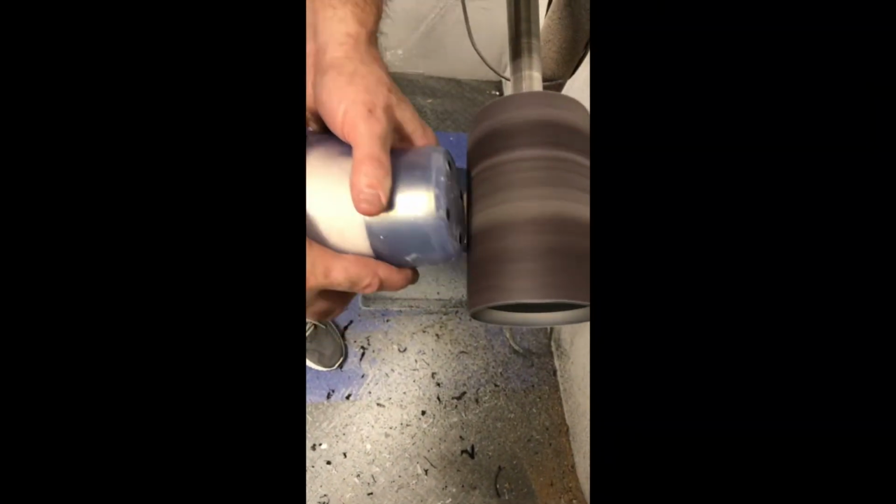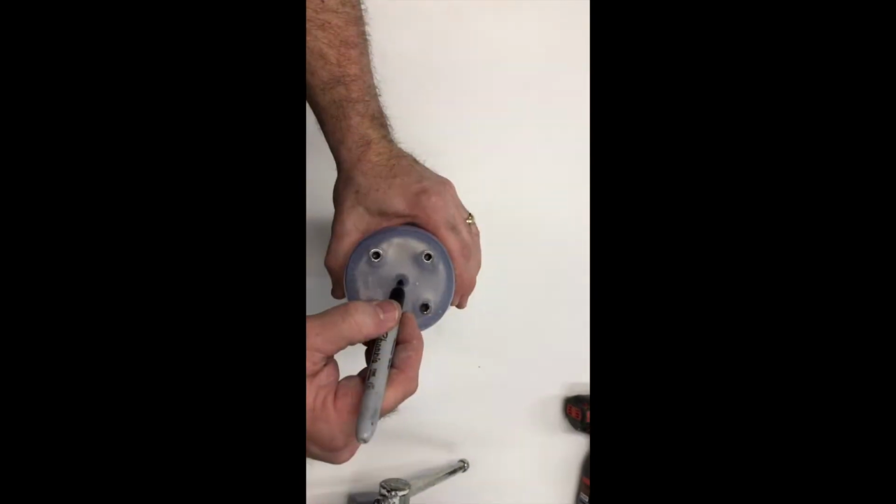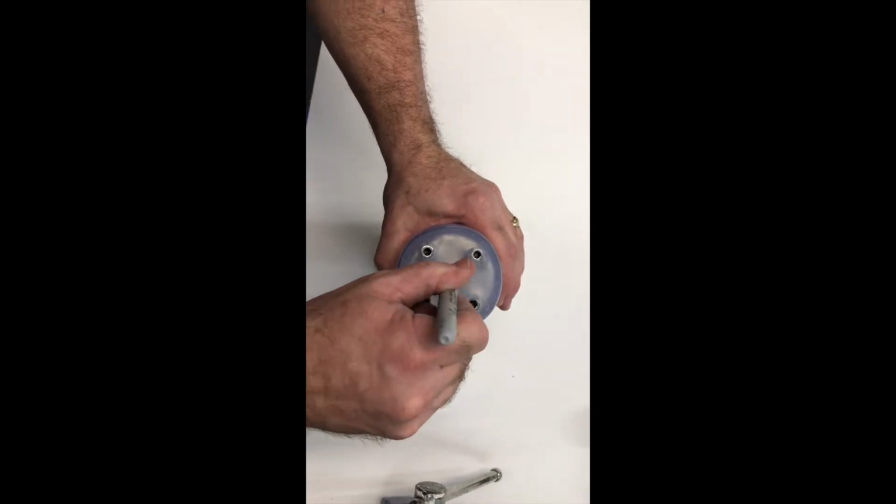Grind the bottom of the socket down to the cap screws. Ensure the distal thickness is uniform. Mark the center hole in the bottom of the socket. This will be drilled out after the dummy and model have been extracted.